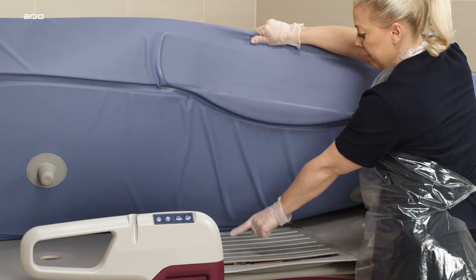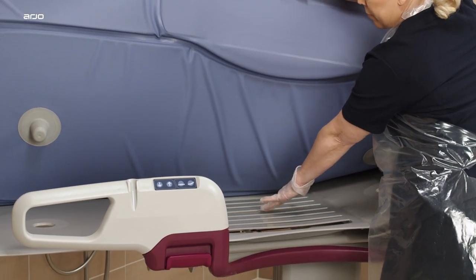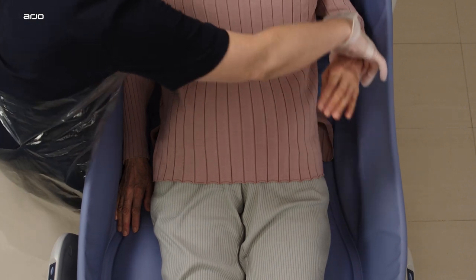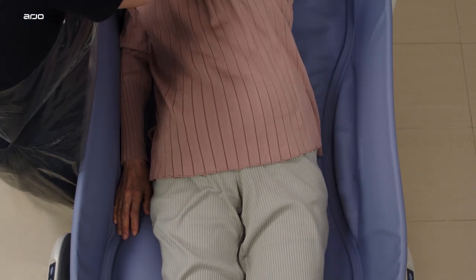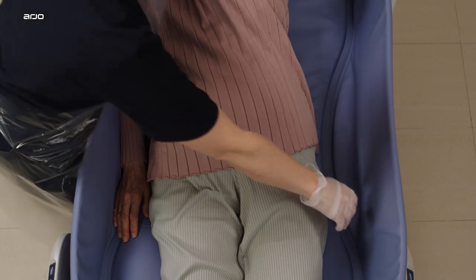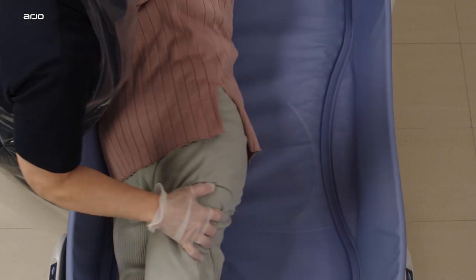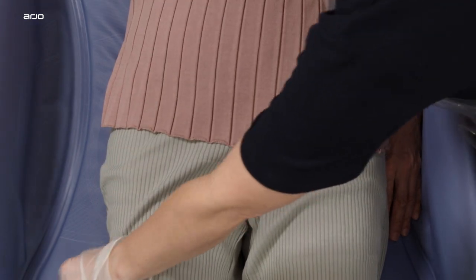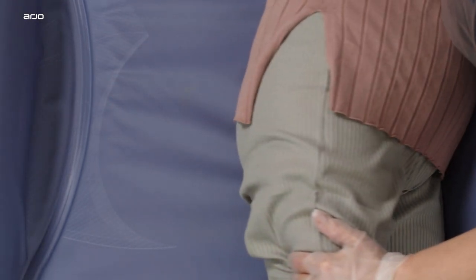The FlexiZone is constructed as a suspension area to distribute pressure on the patient or resident's lower back, coccyx and hips, and improve the comfort level. For an optimal comfort level, position the patient's buttocks centrally in the FlexiZone. The mattress has a graphic outline with an illustrated human figure on each side. Position the patient's buttocks within the graphic outline on the mattress.